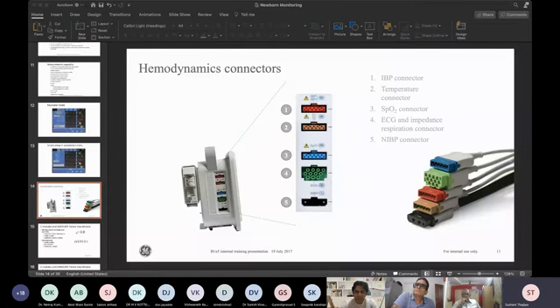It's very difficult to choose on accuracy. It also depends on what kind of protocols you have and what kind of patients you have in general. But I would say there's very little to choose between these technologies. With Masimo, the focus also is on movement, which is why some people prefer it. But there are no specific algorithmic differences in terms of how these technologies work with GE and Philips. These are just proprietary technologies. That's what it is.